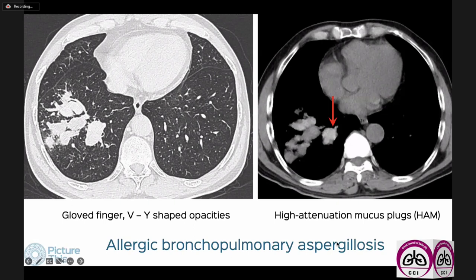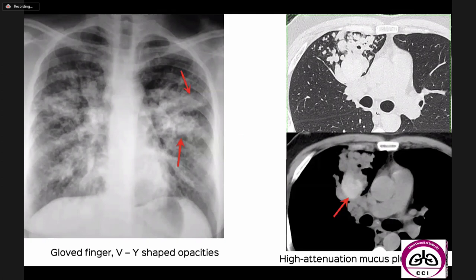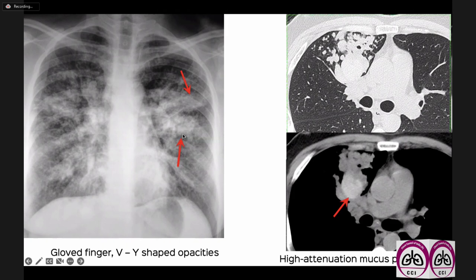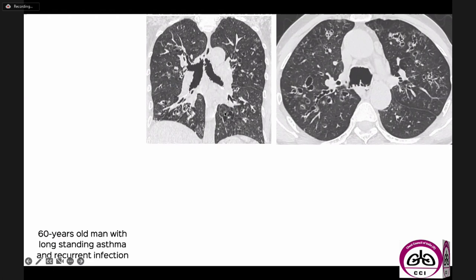More commonly in our country we have patients with asthma and bronchiectasis with this proximal central bronchiectasis quite typical of allergic bronchopulmonary aspergillosis. The pathognomonic CT sign is the presence of high attenuation mucus plugs going along the dilated bronchi, producing gloved finger and V- and Y-shaped opacities. This is an immune response to aspergillus. On radiographs, you can see this gloved finger appearance with high attenuation mucus plugs — this is reasonably typical of ABPA.